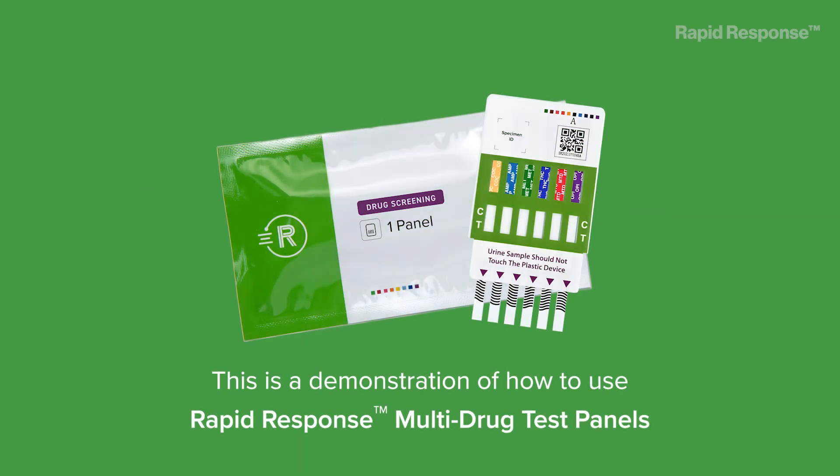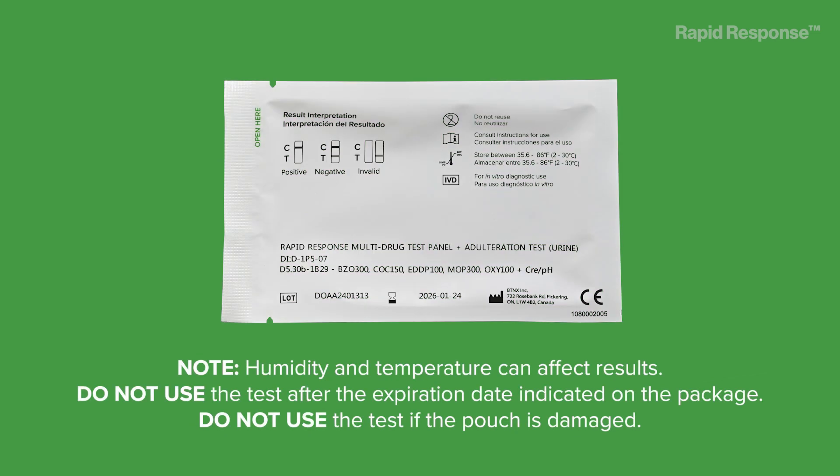This is a demonstration of how to use Rapid Response multi-drug test panels. Note: humidity and temperature can affect results. Do not use the test after the expiration date indicated on the package. Do not use the test if the pouch is damaged.